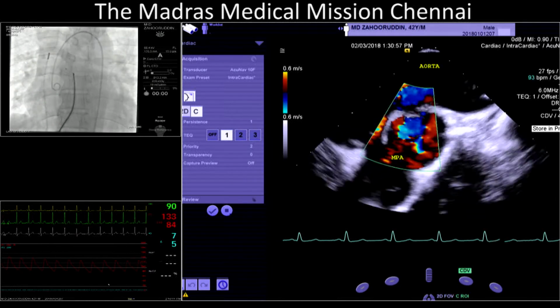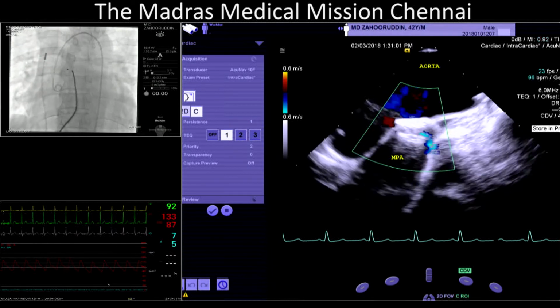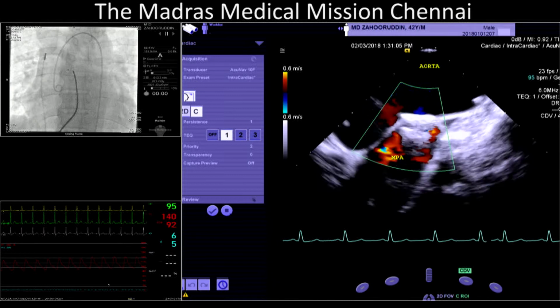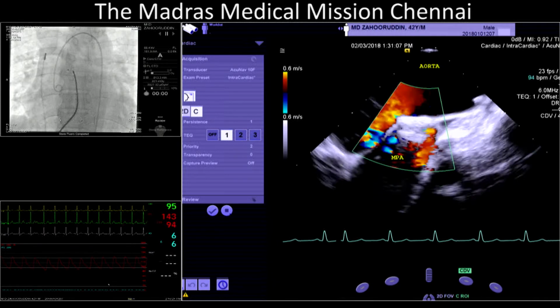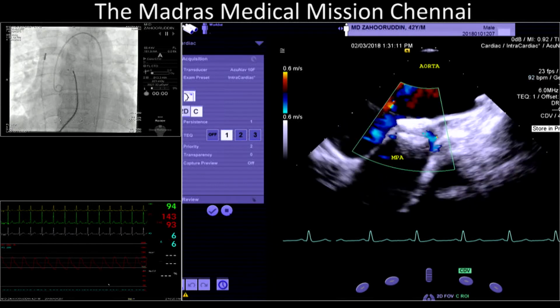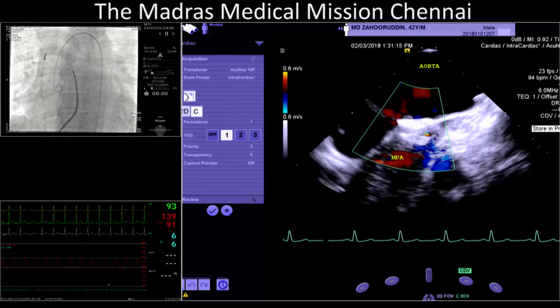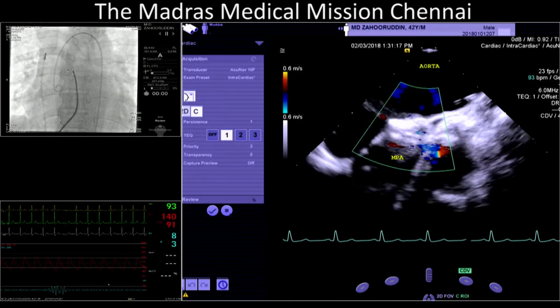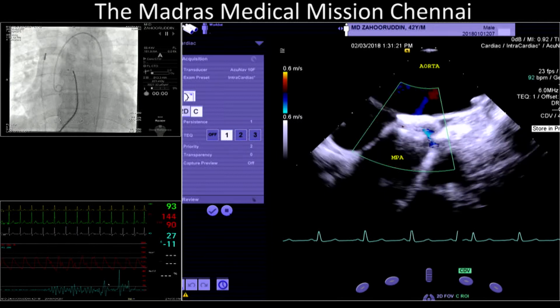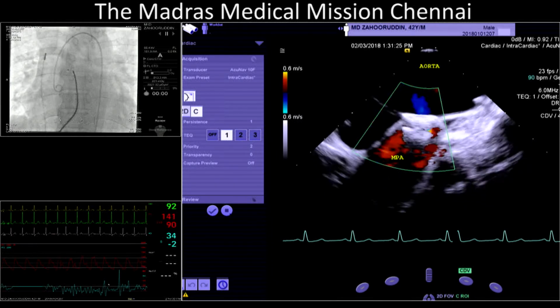So now the device is in. I'm pushing it up. How do you feel, Dietmar? That looks very nice, but how do you make the decision now that it is stable? We have had a big discussion before with the ASD occlusion here in Saigon by Tin, but what makes you, let me say, convinced that the device is not too small? I will do a Minnesota or a Gießen wiggle now.